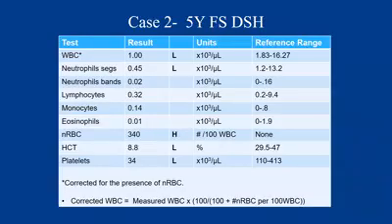So when we actually did our differential, look at that: our white cell count was not 4,000, it was actually 1,000. This patient is actually leukopenic. And why is that happening? Well, the analyzer counts nucleated cells as white cells. So it's classifying these nucleated red blood cells erroneously as white blood cells and including them in the white cell count, potentially classifying them as lymphocytes or monocytes depending on the analyzer.